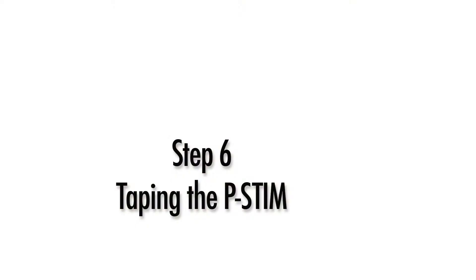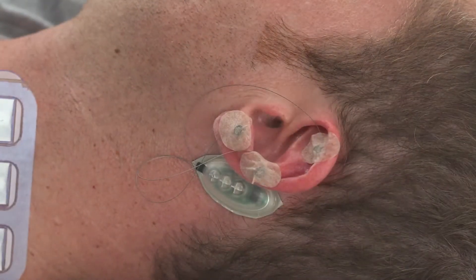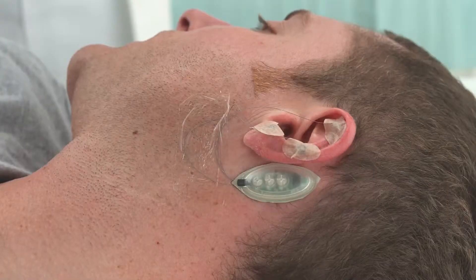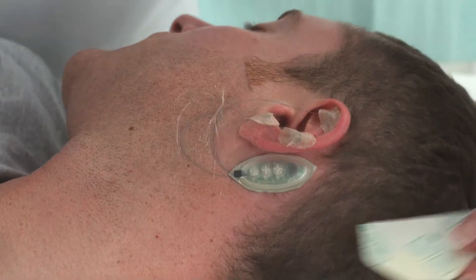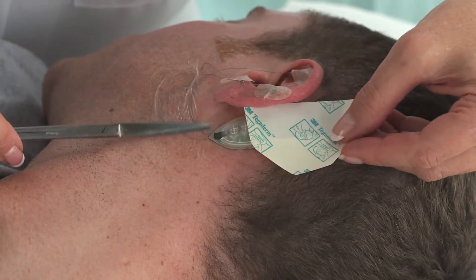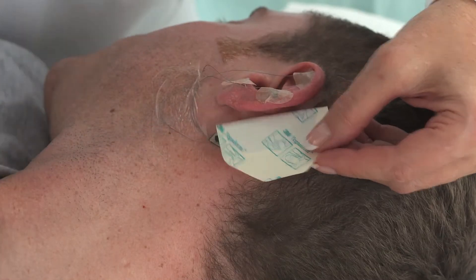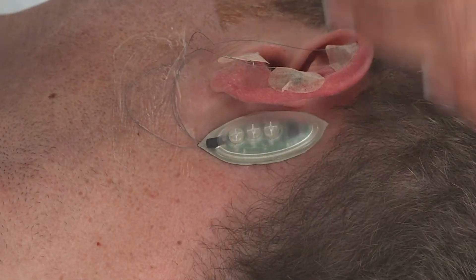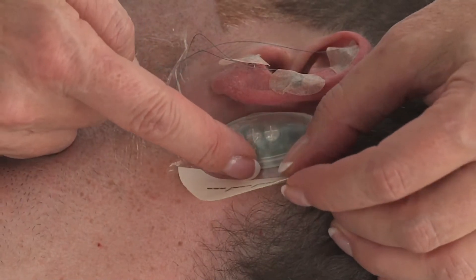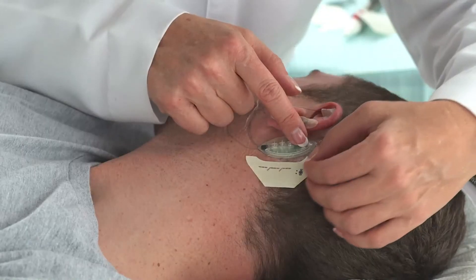Taping the p-STEM. Cover each needle with the oval adhesives. Using Tegaderm, tape the wires to the patient's neck. Position the second piece of Tegaderm tape over the p-STEM control module, noting where the tape covers the wire insertion point. Using scissors, cut the Tegaderm tape around this area to avoid covering the wire insertion point of the device. The device will not operate properly if the wire insertion point is covered with tape.